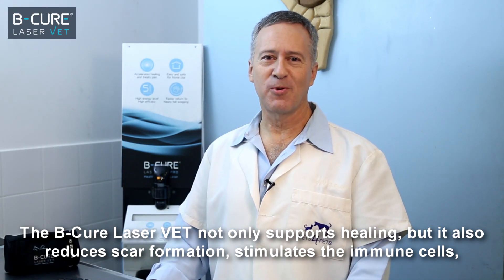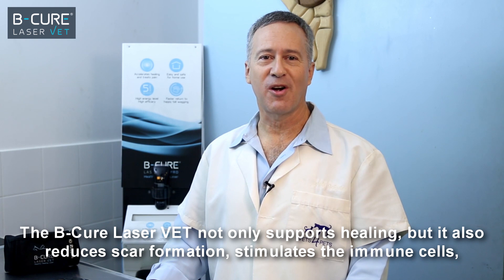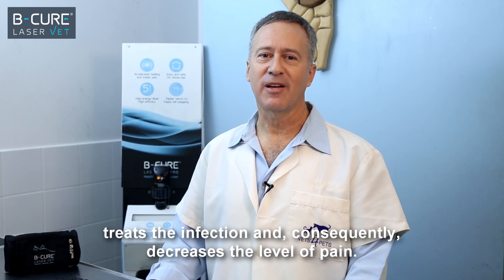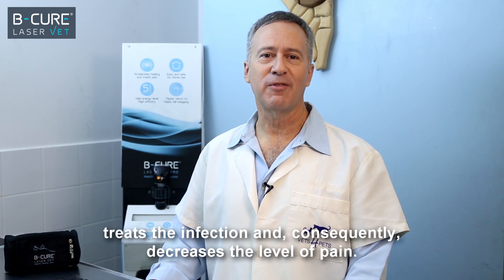The BeCure LaserVet not only supports healing, but it also reduces scar formation, stimulates the immune cells, treats the infection, and consequently decreases the level of pain.